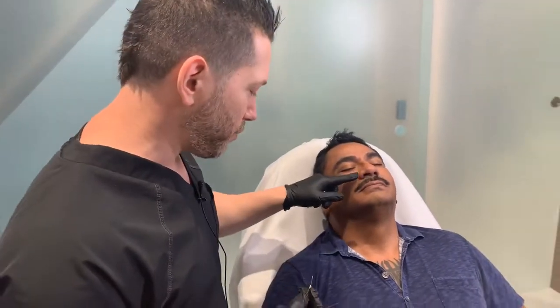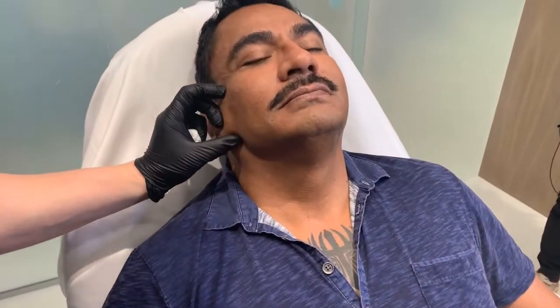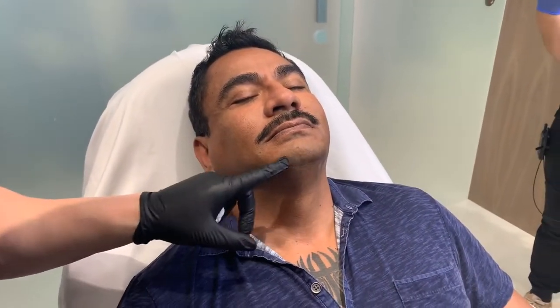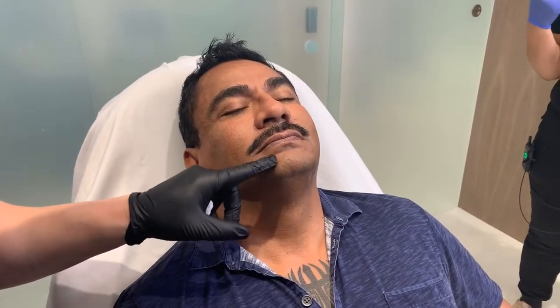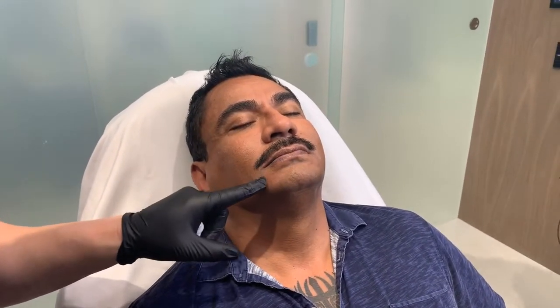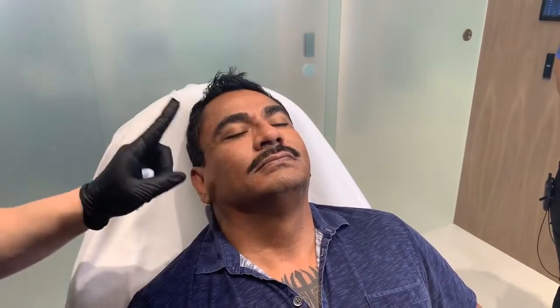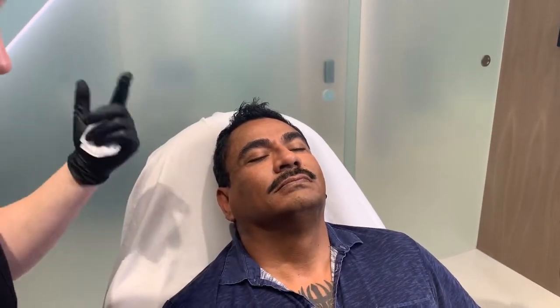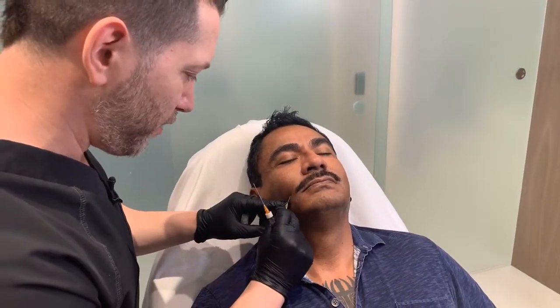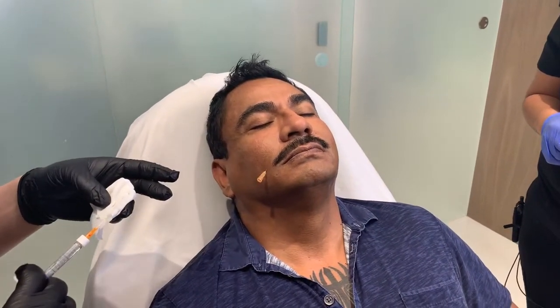It's done really well, but it's bothering him that he has a little bit in the folds, and if you take a look at his overall face, he's a little wider here, but has a little bit less projection in the chin area. As you age, this area comes down a little bit, you lose volume around the mouth, the corner of the mouth turns down, and you get this crease right here in the middle. So our goal is just to fill this slightly around to give him some enhancement. I'll make it easy for him and not have a lot of downtime, because sometimes men tend to want to bleed a lot.